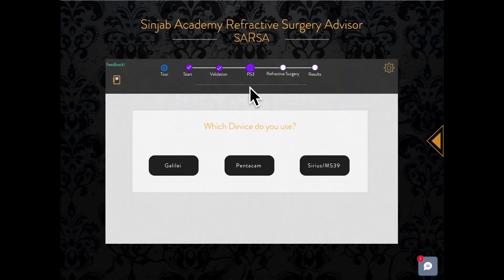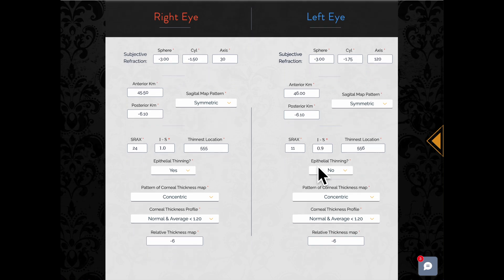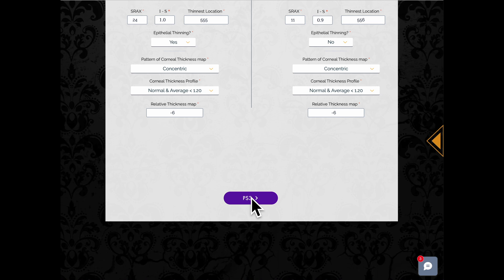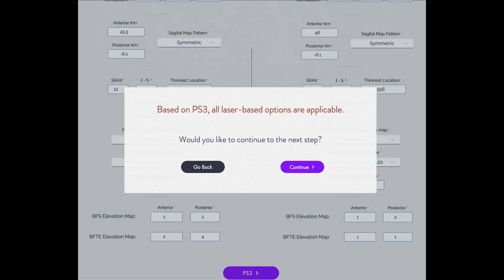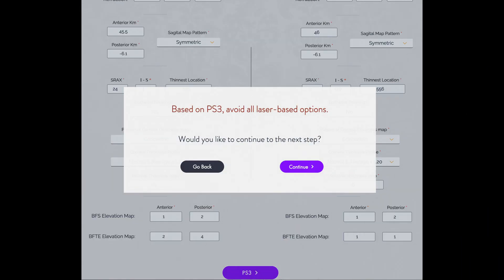The next step is the Practical Subjective Scoring System, the PS3. The PS3 is designed by Professor Sinjab to assist you in making the proper decision in laser-based refractive surgery. You can select the system that best fits your practice. After filling the blanks and pressing the PS3 button, Sarsa will process the data and display one of three messages: all laser-based options are applicable, some of them, or none of them.